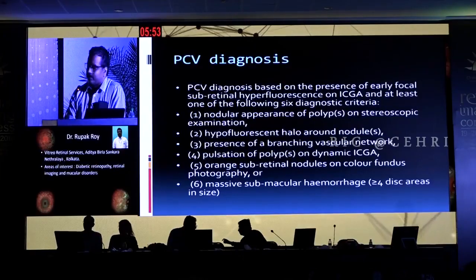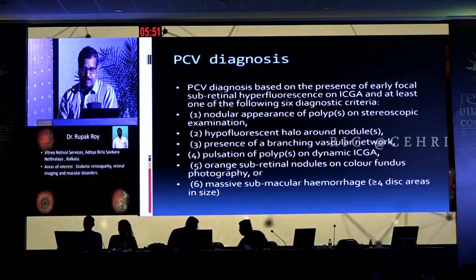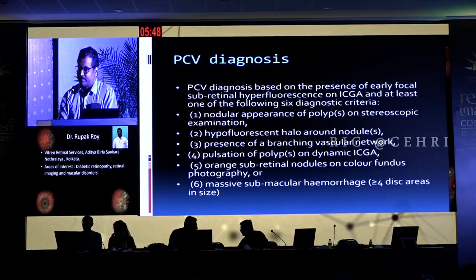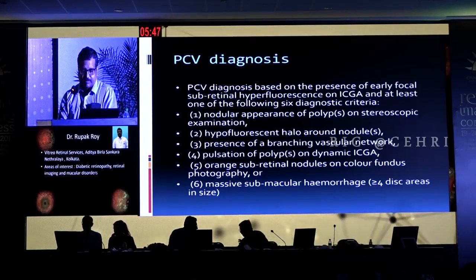I will be speaking on choroidal knuckles. The PCV diagnosis gold standard, as we all know, includes nodular appearance, hyperfluorescent halo around the nodules, presence of branching vascular network, a pulsatile polyp, orange subretinal nodules that can be seen clinically, or massive submacular hemorrhages. This was the original criteria on which the Everest study was based.